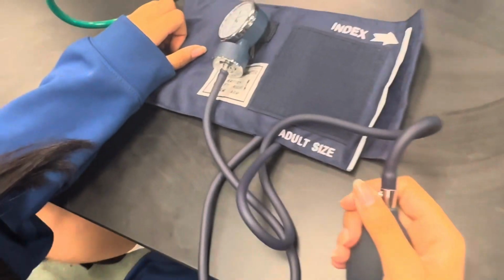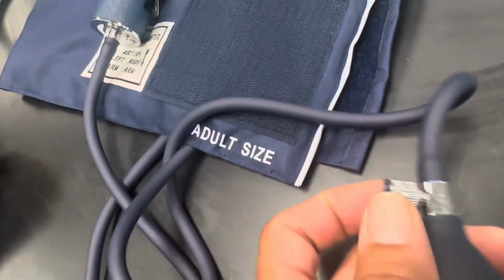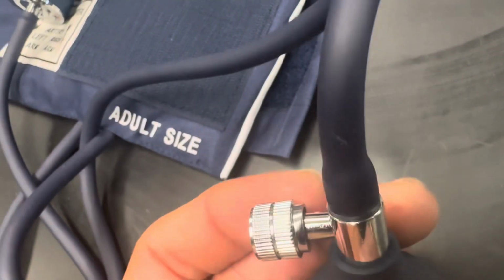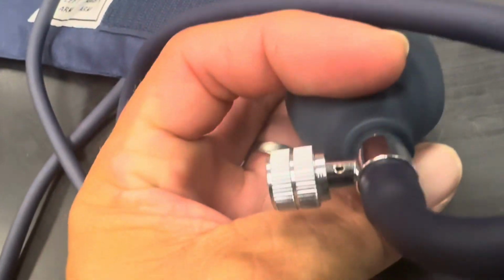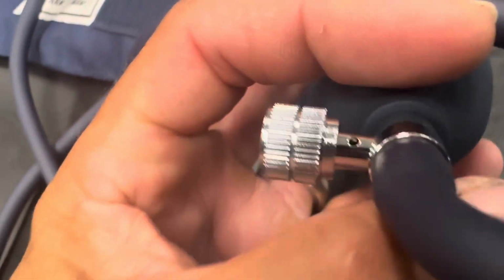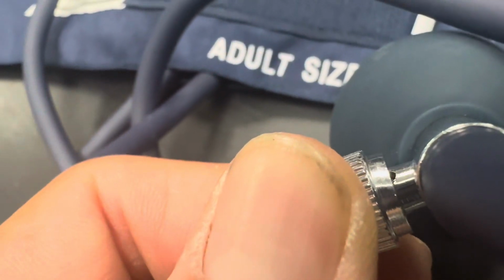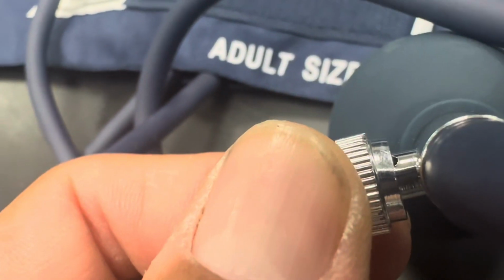All right, the first part of the blood pressure skill is you're gonna close the knob. There's a hole right there. And so when we close the knob, it closes and it actually covers most of the hole, which then covers where the air is going to come out. So when we open the knob, that means that the air gets released.